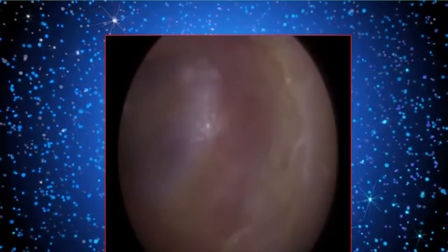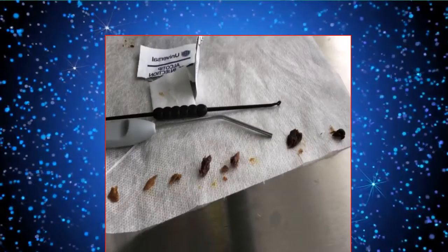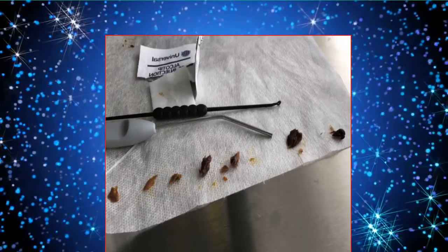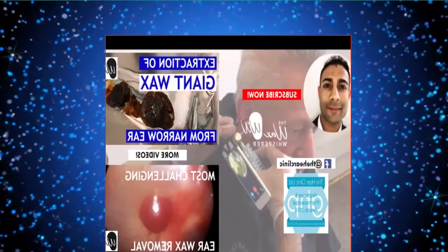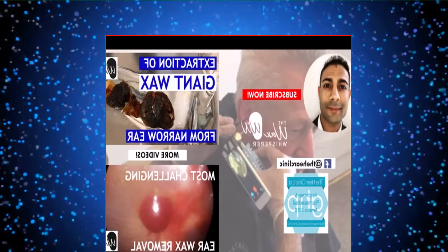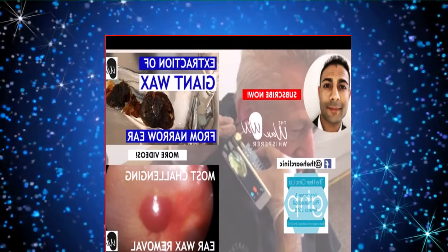So that's the final piece of dead skin that I managed to remove. There's the client's eardrum, fully visible, intact, with a good light reflex. The light reflex is the white shiny patch on the eardrum, and that's a reflection from the light that we're amplifying inside the ears, which helps us to visualize what we're doing.